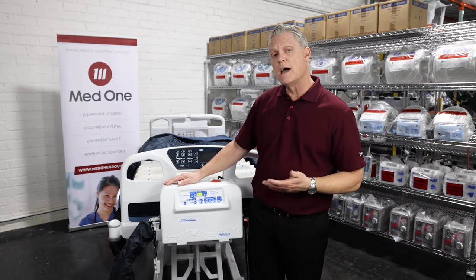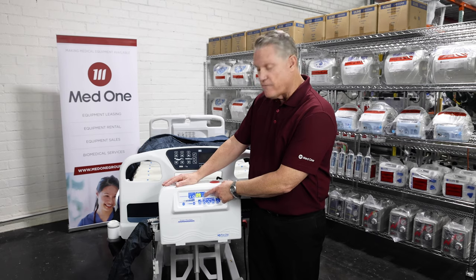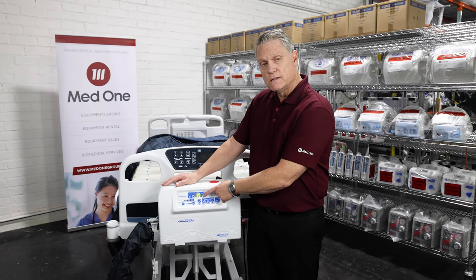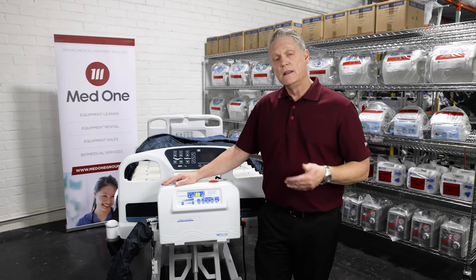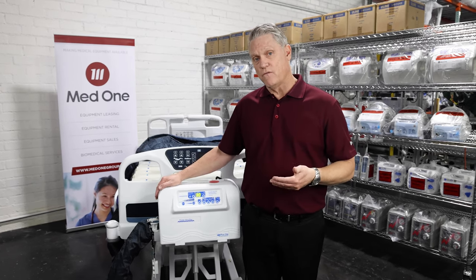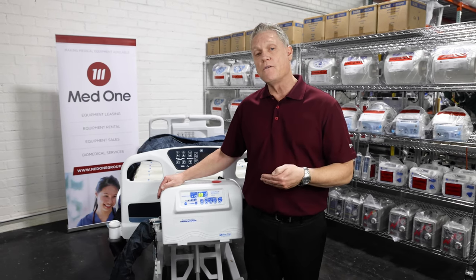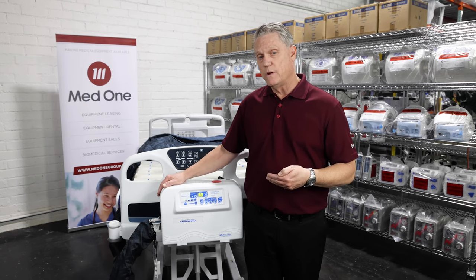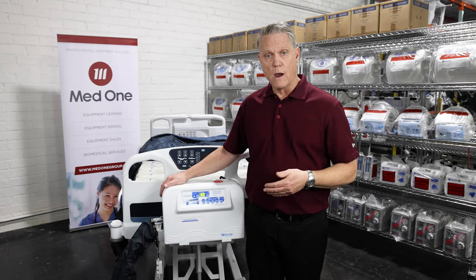It is adjustable as well through a timer. We can set the cycle timer to however often we would like it to cycle. Your range on that is anywhere from 5 minutes to 10 minutes to 15 minutes, 20, 25, all the way up to 30 minutes. It is adjustable for a reason. If your patient finds that the movement keeps them awake at night, you can simply turn the feature off or you can adjust it to up to 30 minutes, so only adjusting once every 30 minutes, twice an hour, allowing your patient to be able to rest properly.